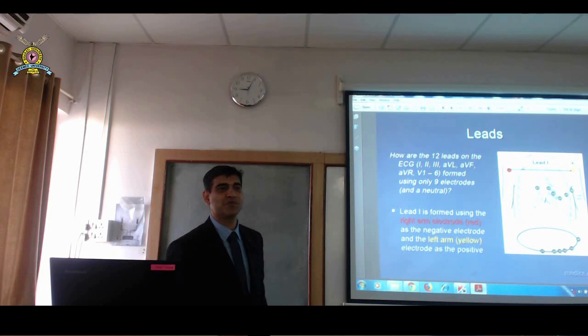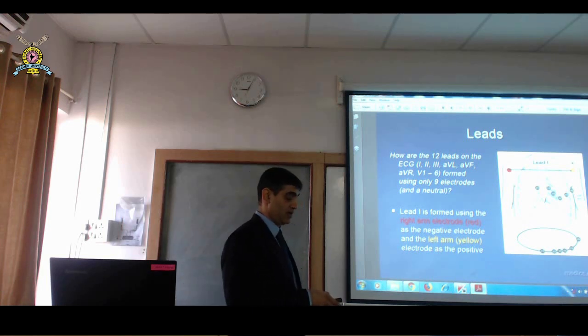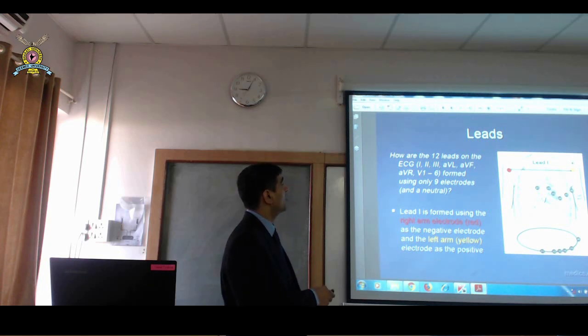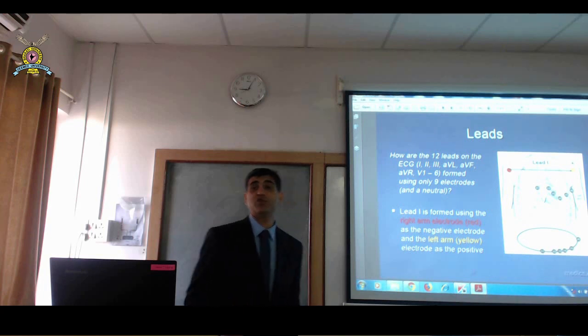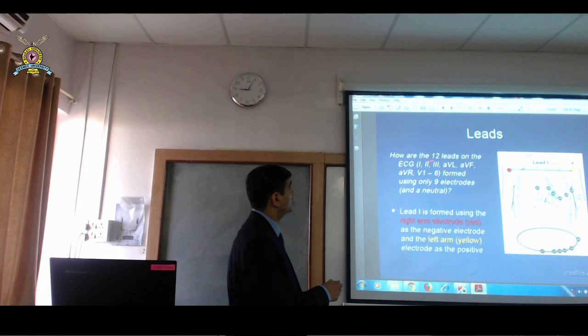Right? No? You don't know how to calculate axis? We'll go through that in our next sessions. So now coming to what lead 1 means, what lead 2 means, and what lead 3 means. Okay, so how are the 12 leads on the ECG?